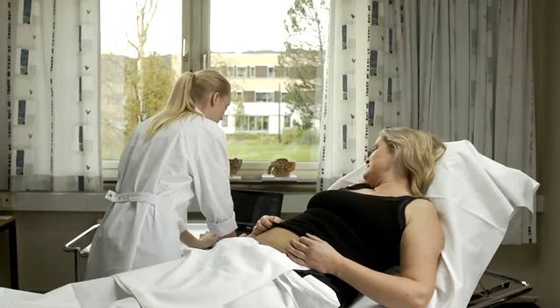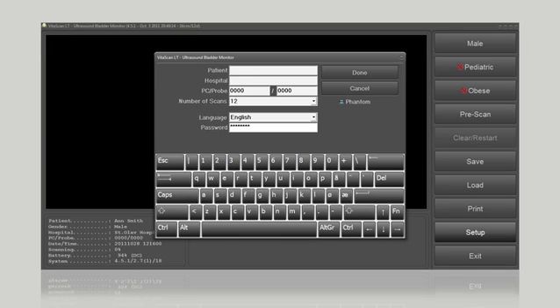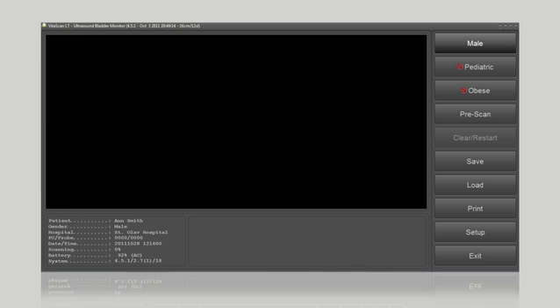The patient's name can be entered if the image is to be saved. Press Setup to type the patient's name and their hospital ID. Press Done and leave the menu.